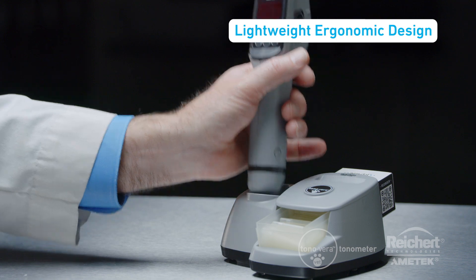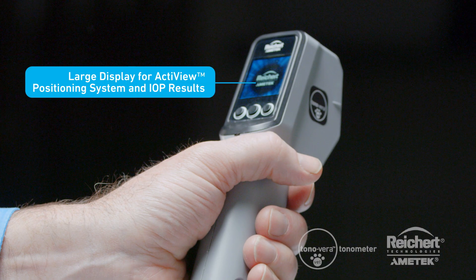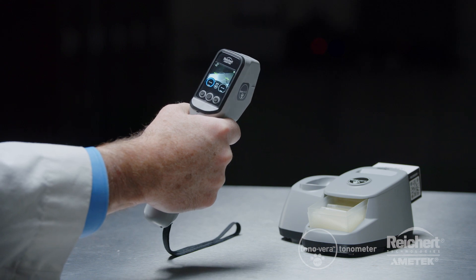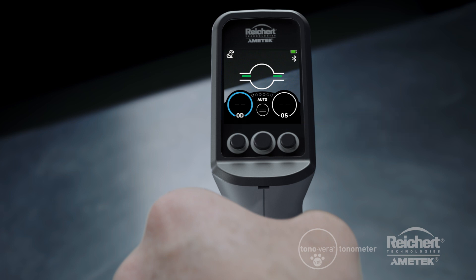The lightweight ergonomic design makes it comfortable to hold, and the large screen located on the back of the device provides a view of the IOP results, making it convenient for both left- and right-handed users. Underneath the screen, there are three multifunction buttons that provide easy access to all the settings and measurement functions.